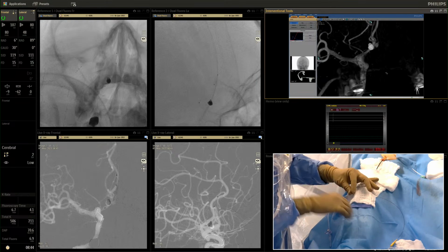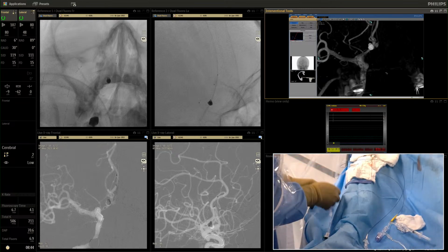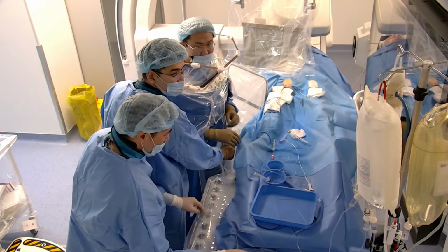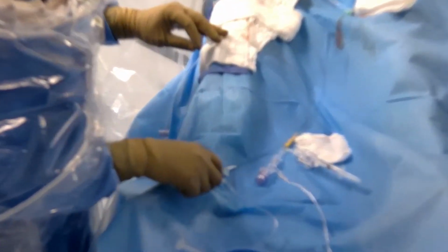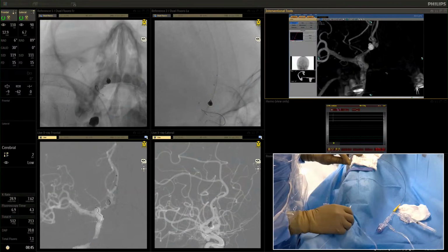The flashing is okay here. Could you give me the flashing with nimodipine? The new one. Okay. I will switch from the pure saline to the flashing with nimodipine. That's okay. A little bit quicker. Go with the Headway 17. It's a straight one, and we'll see.